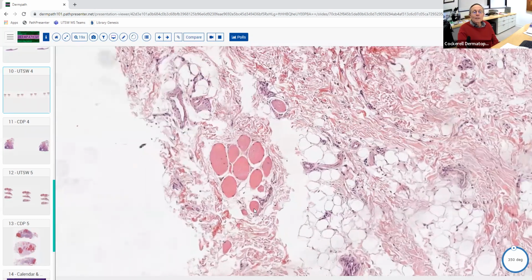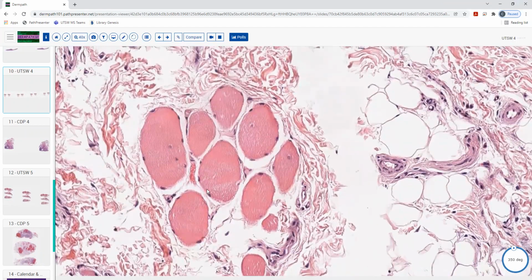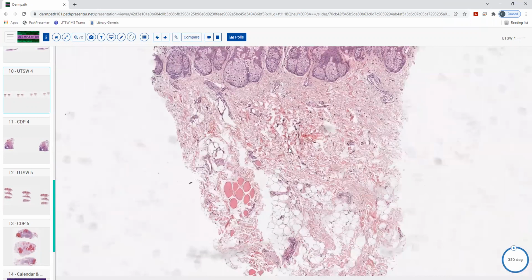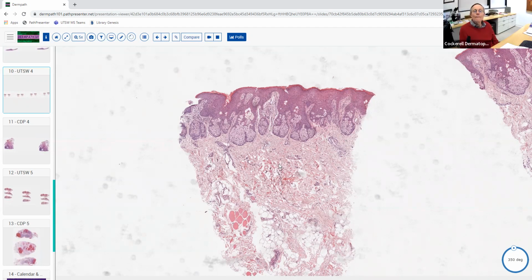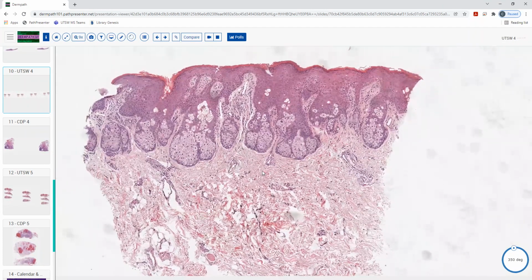down there. Yeah, there's some muscle here. Actually, is it? Or striated, yeah. Actually it's skeletal muscle, interestingly. Skeletal. So that makes me think about location. Not that it really helped me, but it made me think about it. And then I'm seeing a lot of what I think are just sebaceous glands within the epidermis. Good. So they don't look particularly odd to me.